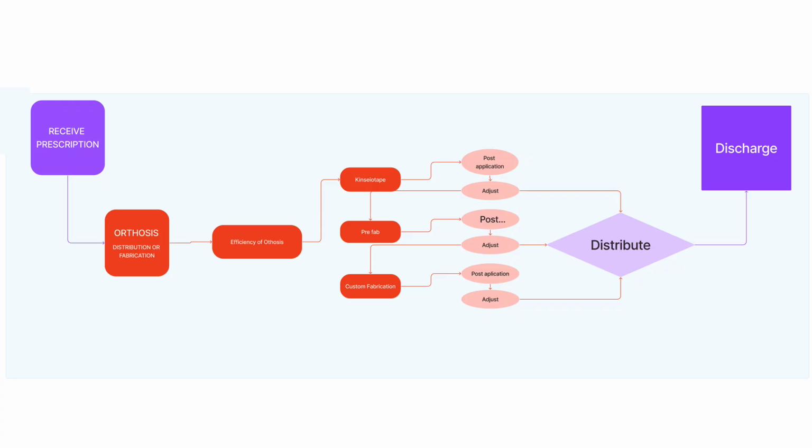A prefabricated orthosis can be provided. Proper fit and adjustment can be determined with the use of the Corbett Targeted Coin Test. The same can be done with custom orthoses, which need to exhibit proper fit after multiple adjustments. And then the application of kinesio tape can also be determined for its effectiveness. I have provided a 4-minute video at the end of this presentation of these clinic scenarios with the use of the Corbett Targeted Coin Test.